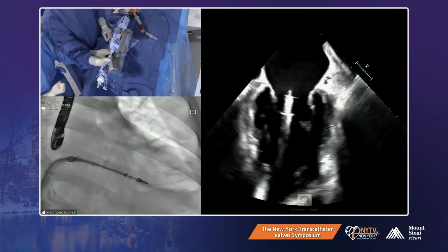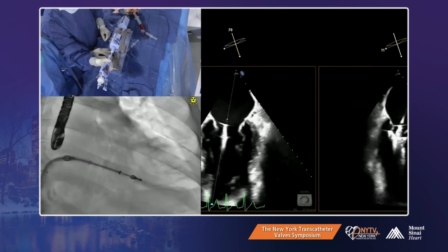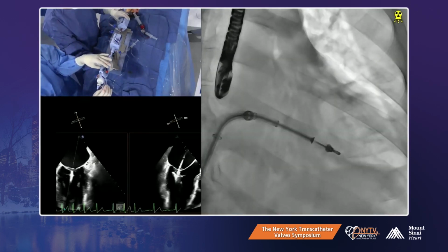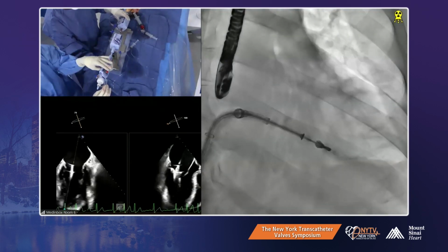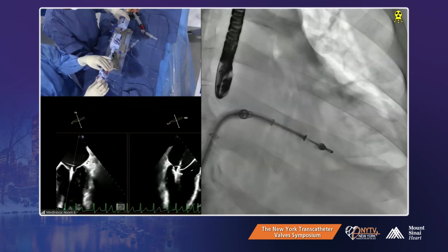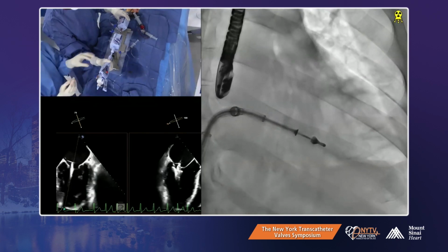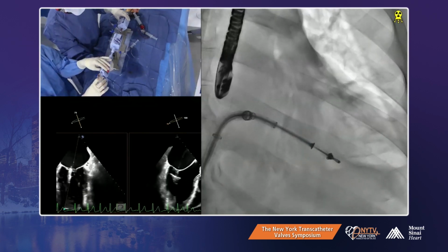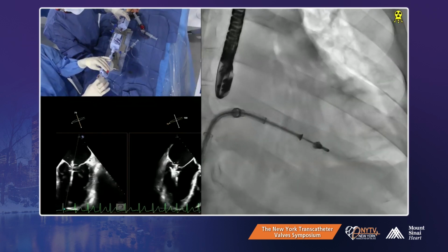So we turned down our tidal volume already. So now we're just fighting the heart rate. Okay, I'm coming back. Okay, we got to grasp. Ready? A little bit more posterior. Posterior is on. It's buckling. Buckling? Yeah. Okay. Should I go more posterior to get it?